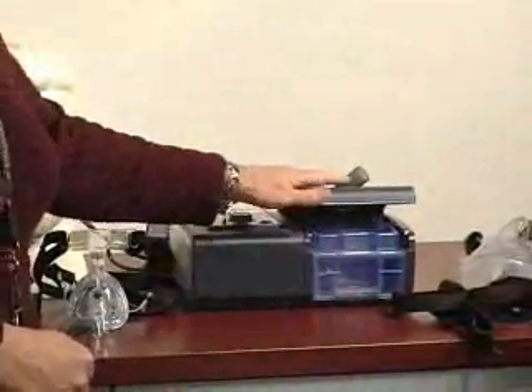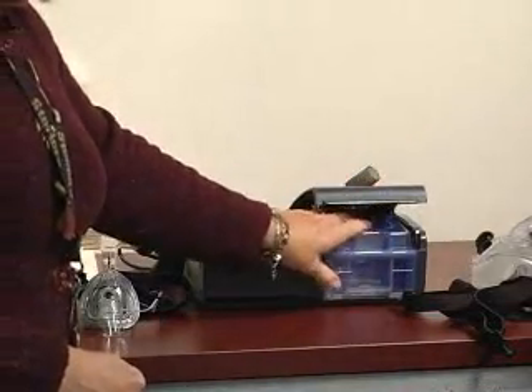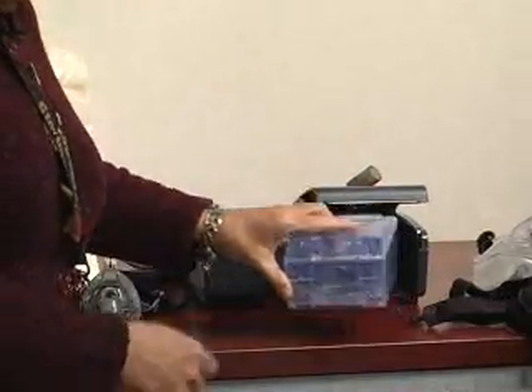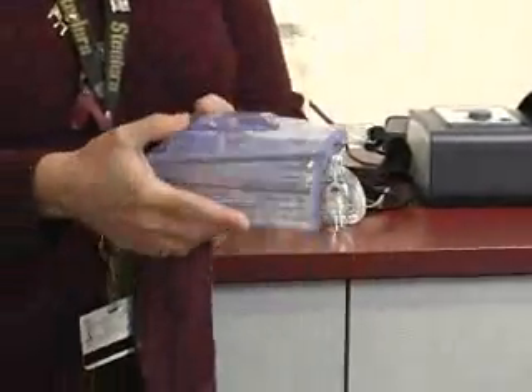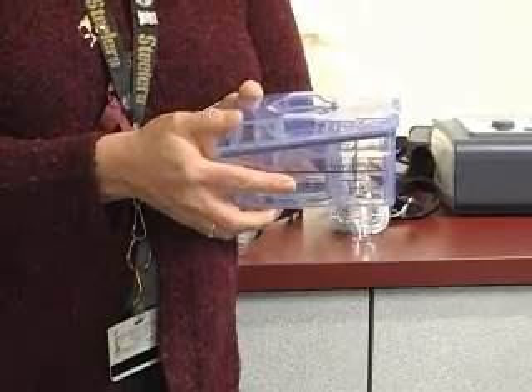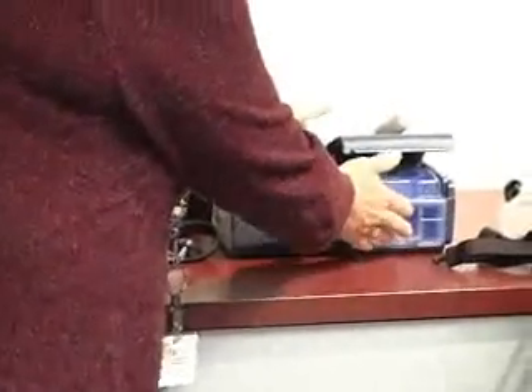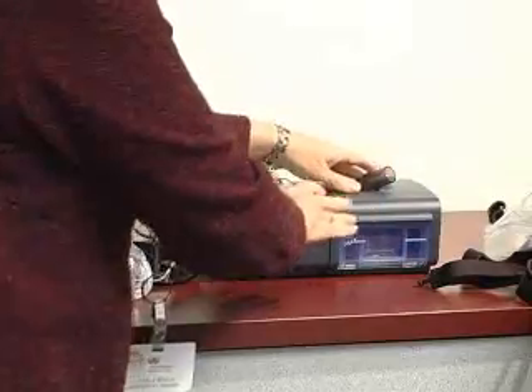For the Sleep System 1 unit, you just want to gently raise the door and slide out the humidifier. With this unit, you want to fill through the top. Again, water level rises — never exceeding the maximum fill line. Insert it back into the unit all the way, pushing firmly so that the door closes firmly.